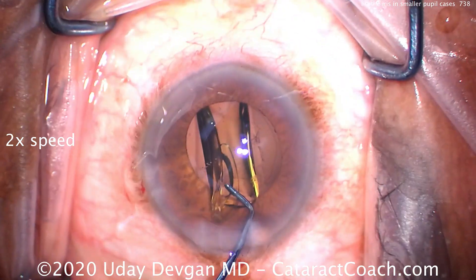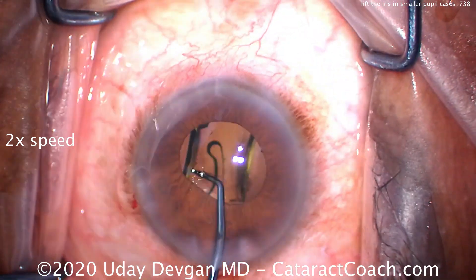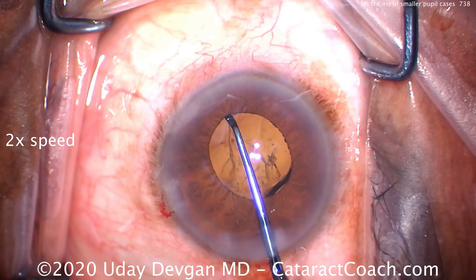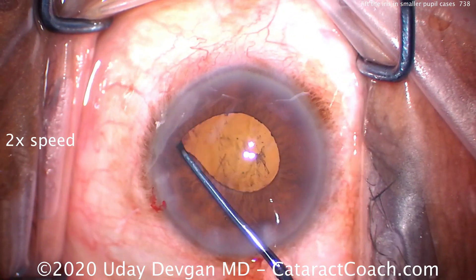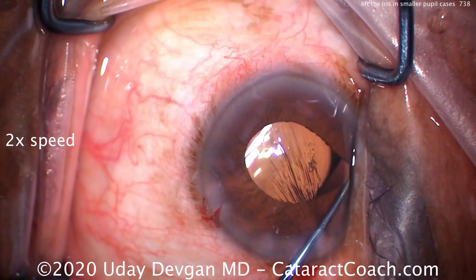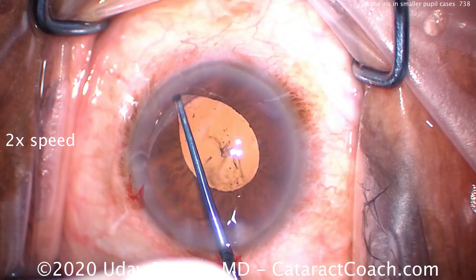This is shown at twice normal speed. We're putting the lens in the capsular bag. The eye is full of viscoelastic and looks pretty good. But look at the pupil size — not the biggest. So using the chopper here, we can lift the iris up and check to make sure that the IOL is in the capsular bag.